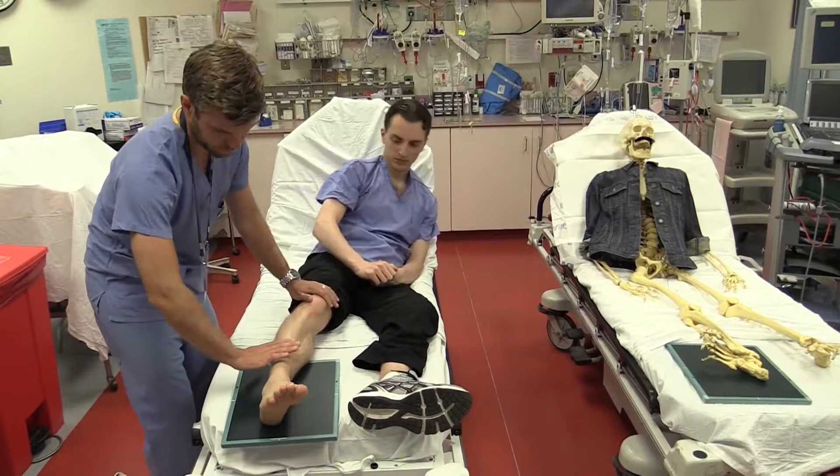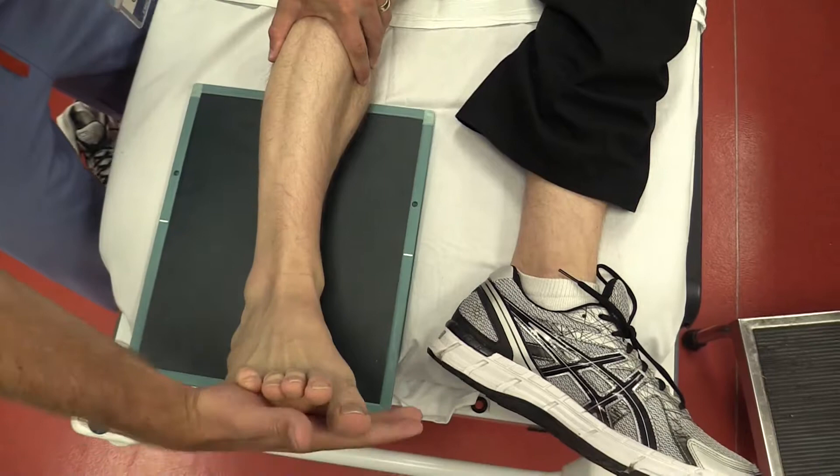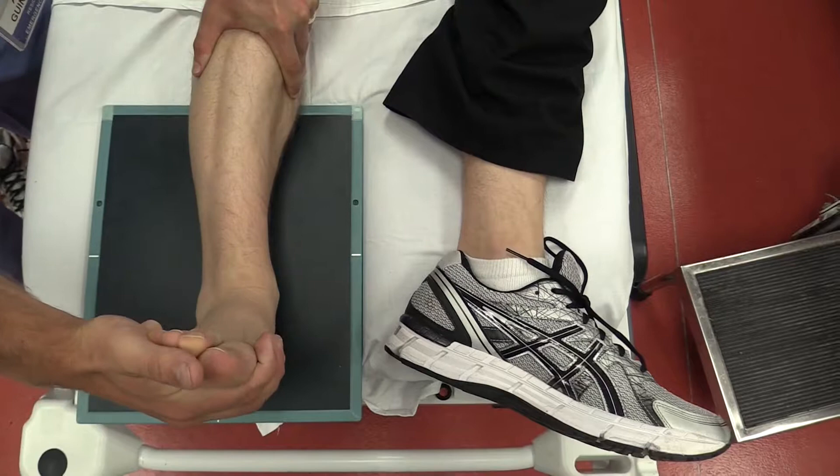Next, dorsiflex the foot. And finally, while maintaining the internal rotation of the leg, externally rotate the foot, bringing the foot parallel to the beam of the x-ray, and shoot. There you have it. And now you know how to do an ankle stress view of an ankle fracture.